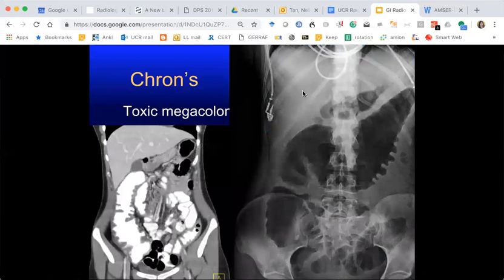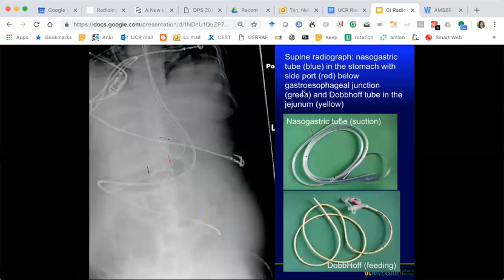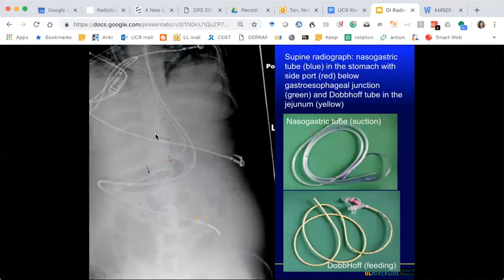What is the side port? The side port of the NG tube is the last hole — there's a radiopaque marker intentionally placed so we can see where the tube is, and the gap is the last hole. You can usually tell where it is in patients with good quality radiographs, though sometimes it's hard when there's a lot going on.